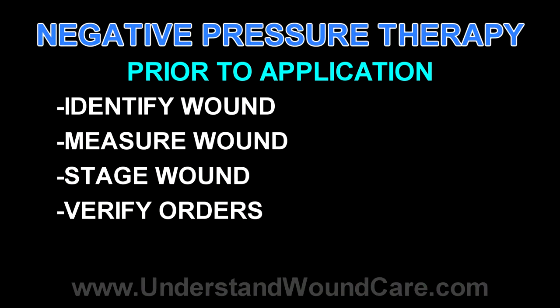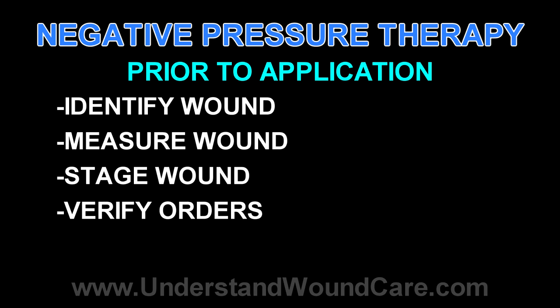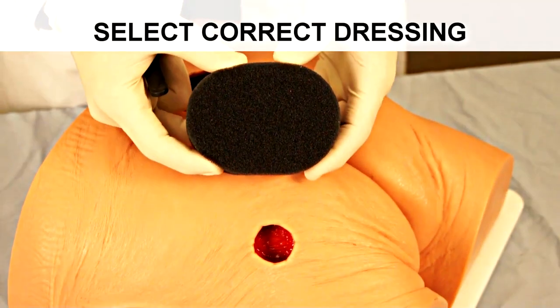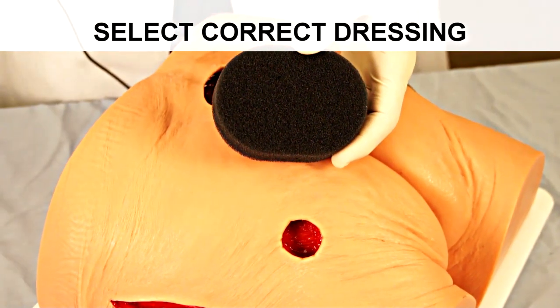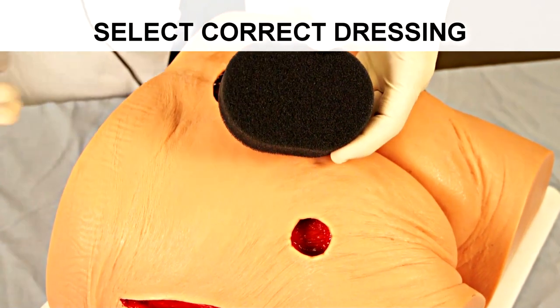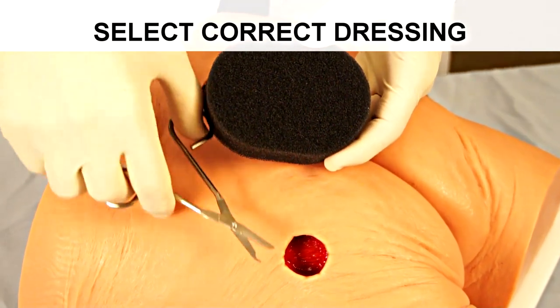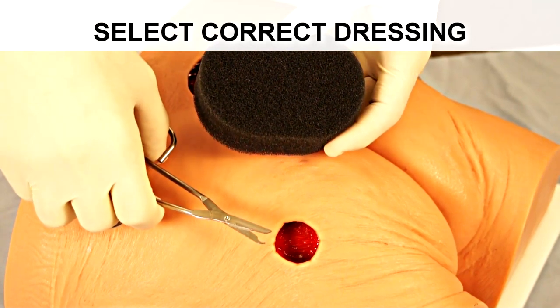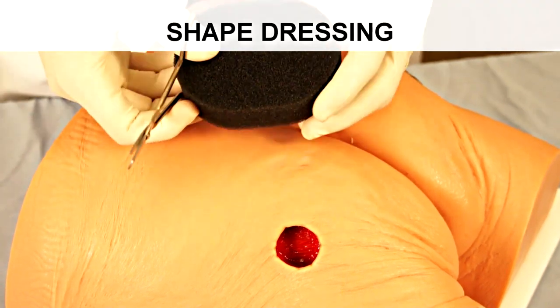Once we have identified our wound, measured it, staged it, and verified that the orders are correct for application of negative pressure therapy, we would go ahead and select an appropriate sponge. This sponge, as you can see, is much larger than the wound. It is now useful to have sterile scissors or a sterile scalpel.